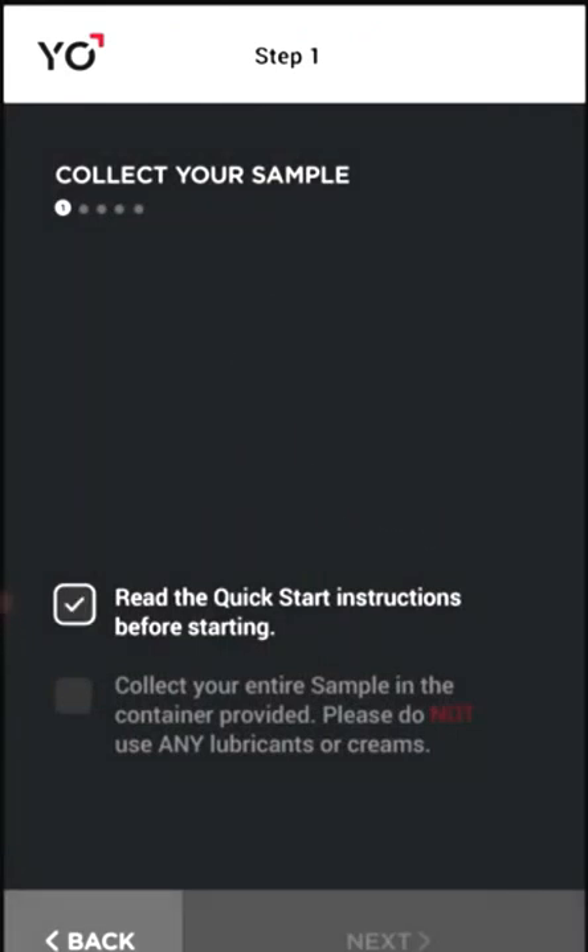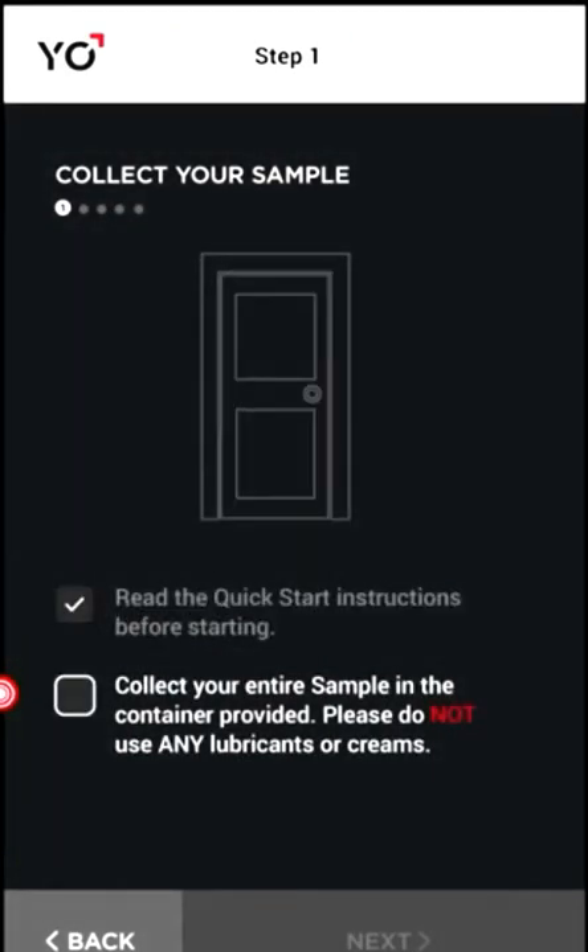It's now time to collect your sample. Please don't use any lubricants, creams, or partners.